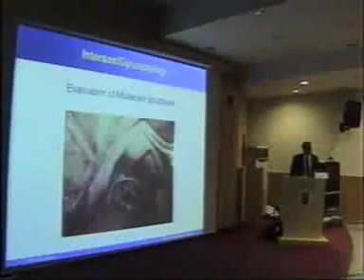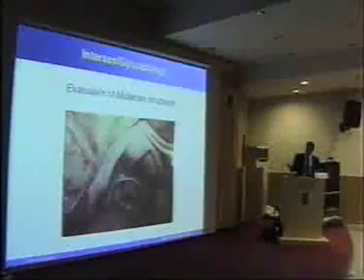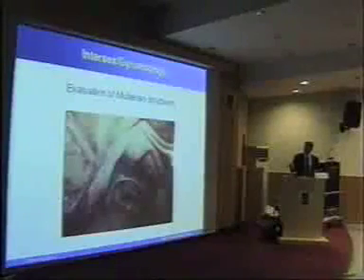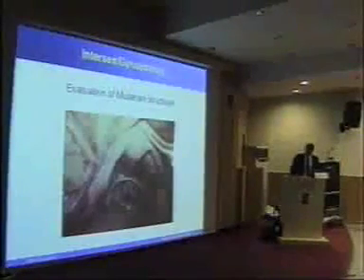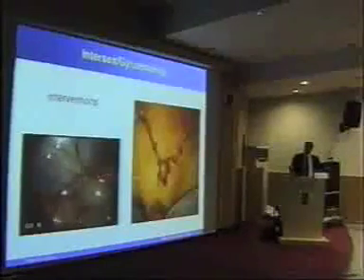And laparoscopy with another port, just so you can manipulate. This is about a 6-month-old baby. Okay, this is quite a big instrument here, but it's the same size as the ones you've been using outside. And this is a baby uterus, which confirms that she was a normal developed female internally. This is an ovarian cyst.